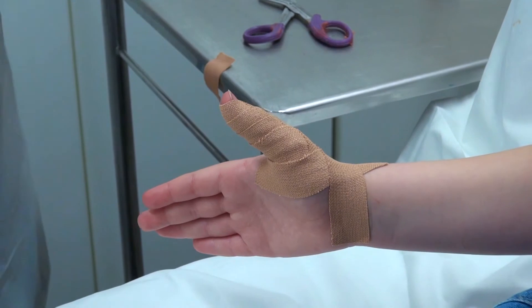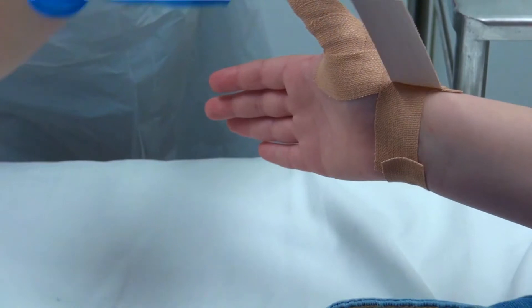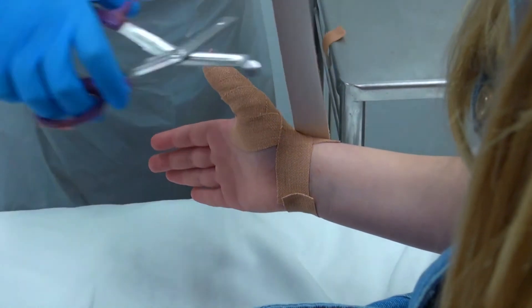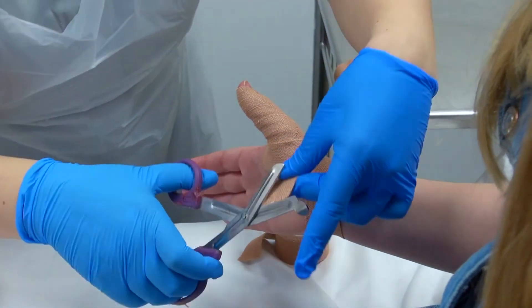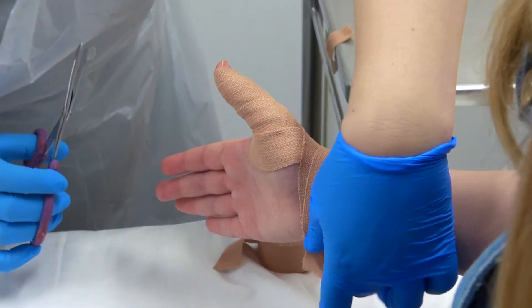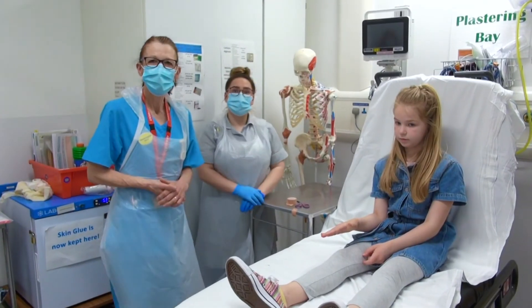Any loose tape, you can just do one loosely just around the wrist. And that's how we apply a thumb spica.